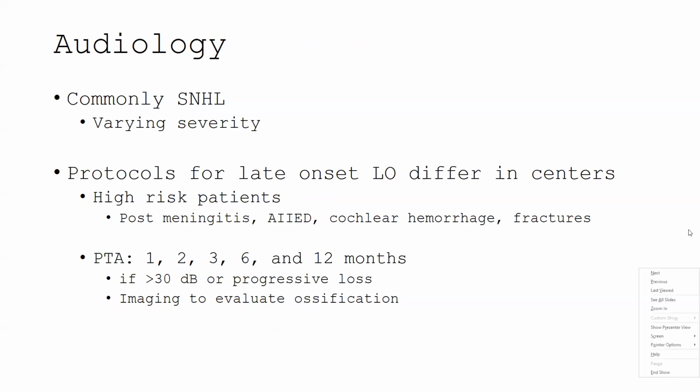There are patients that we know are at high risk of developing labyrinthitis ossificans. However, there are no clear guidelines on when you would repeat the audiology, especially in post-meningitic patients, patients with autoimmune inner ear disease, patients with cochlear hemorrhage and fractures.